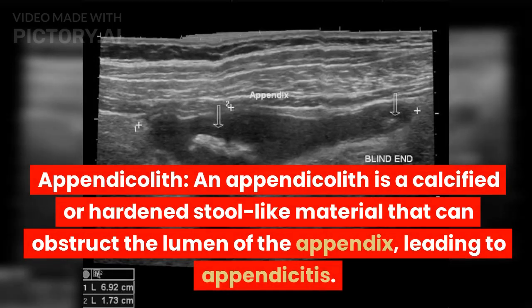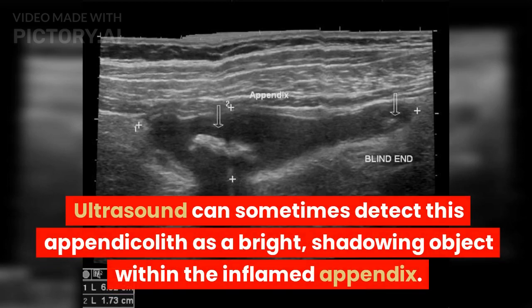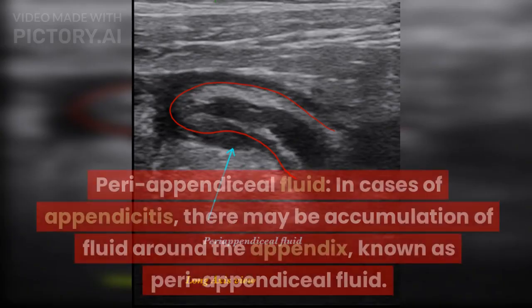Appendicolith. An appendicolith is a calcified or hardened stool-like material that can obstruct the lumen of the appendix, leading to appendicitis. Ultrasound can sometimes detect this appendicolith as a bright, shadowing object within the inflamed appendix.